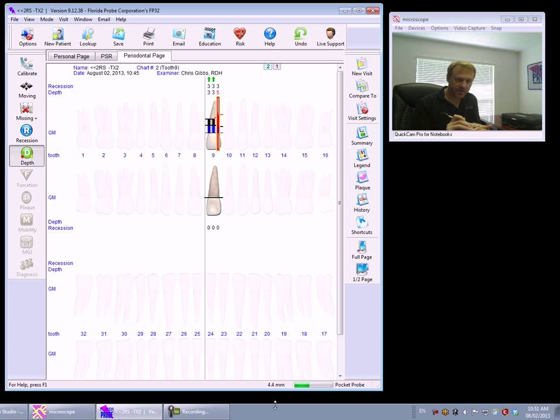So this is obviously my distal, 4. My straight, 3. And my mesial. 3. So now I'm done. I've recorded the 9 numbers that I needed.